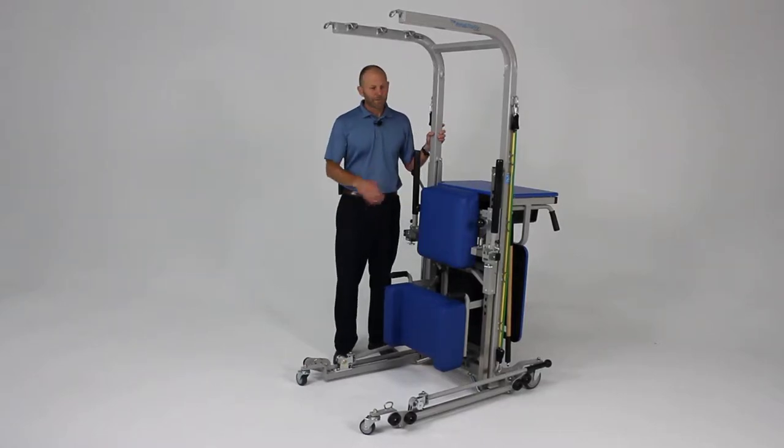This is an overview of the many features of the rehab station, probably one of the most versatile pieces of rehab equipment that you can purchase.